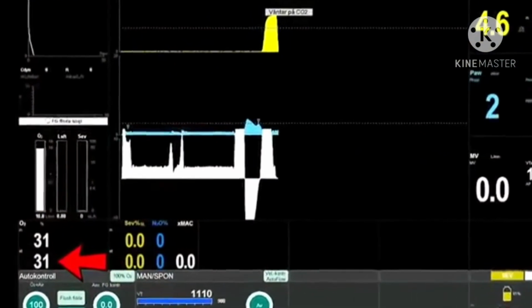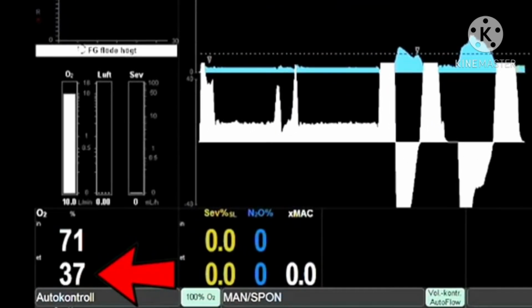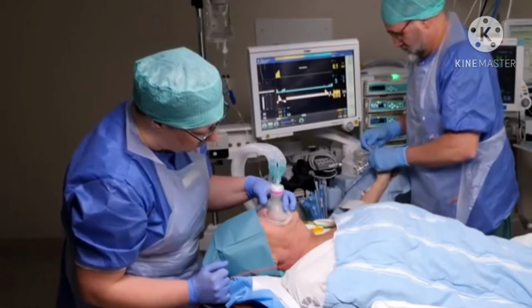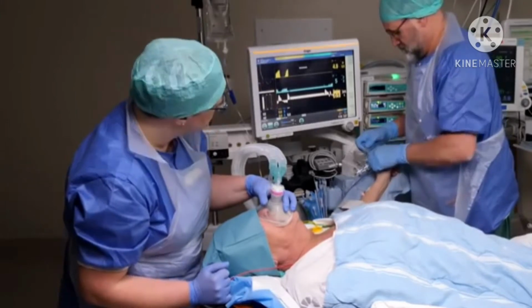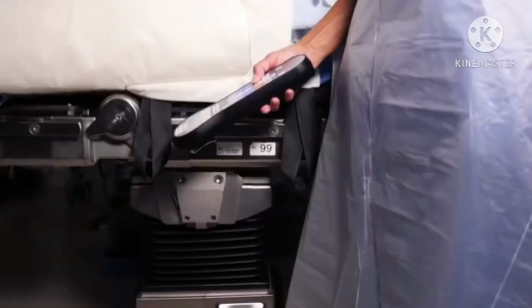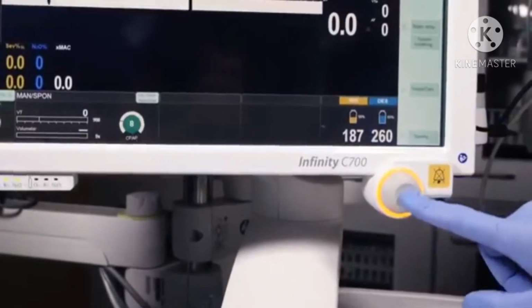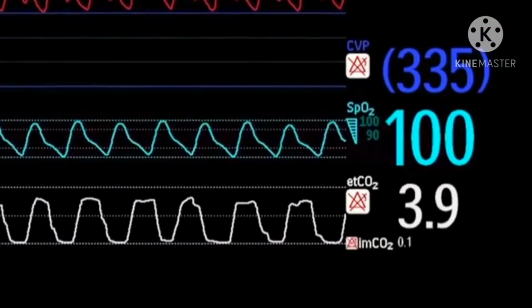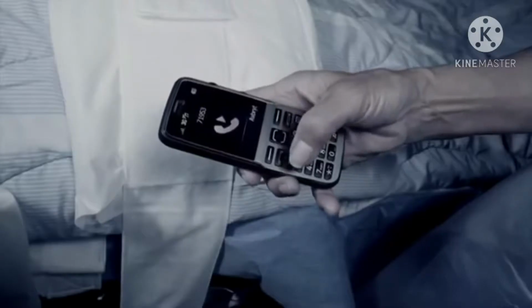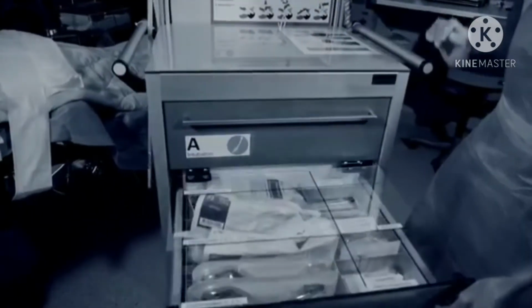Have the patient inhale 100% oxygen through a tight-fitting mask. When the measured expiratory or end-tidal oxygen concentration exceeds 80%, you've loaded up an oxygen reserve in the periphery of the lungs. If this monitoring is unavailable, pre-oxygenate for a minimum of 3 minutes. Pre-oxygenation can be further improved, especially in the obese, by tilting the table and by applying a positive end expiratory pressure. This extra oxygen in the patient buys you potentially life-saving time if you have unexpected airway difficulties, precious time to call for help or try more advanced techniques.